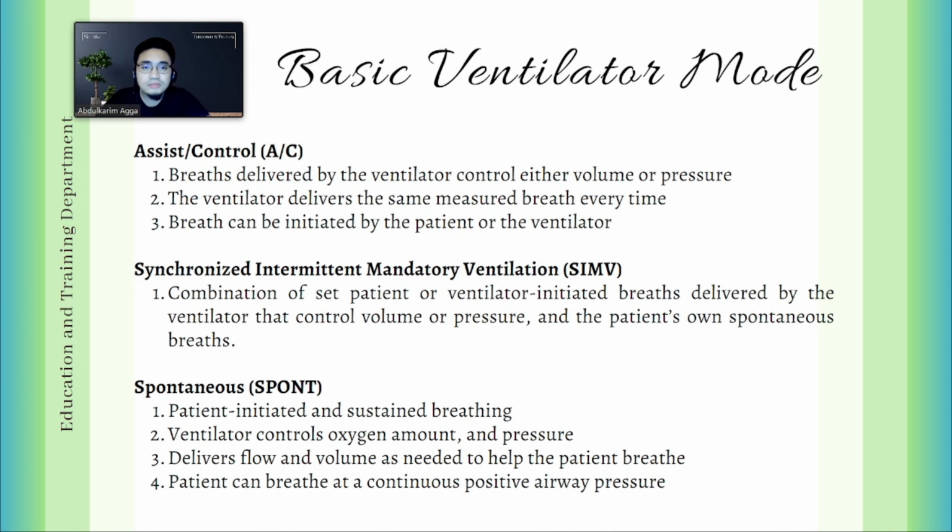It only means that with the triggering factor coming from the patient, or whether the patient does not breathe on his own, ventilators on AC mode will deliver the pressure or the volume needed for the patient to breathe. Again, to make it simple, the one in charge of breathing is your ventilator.